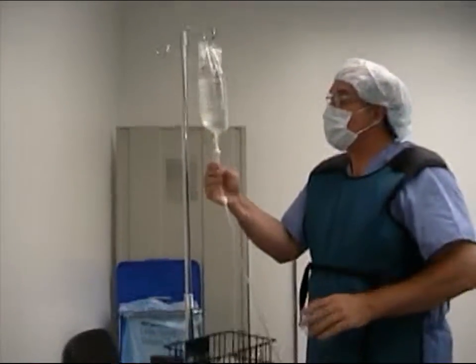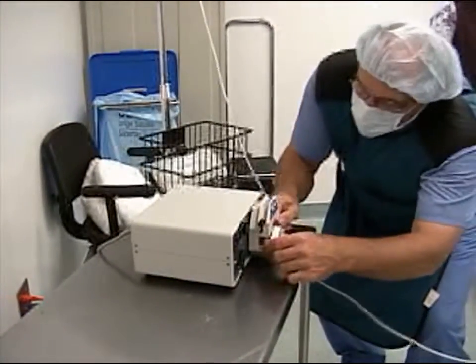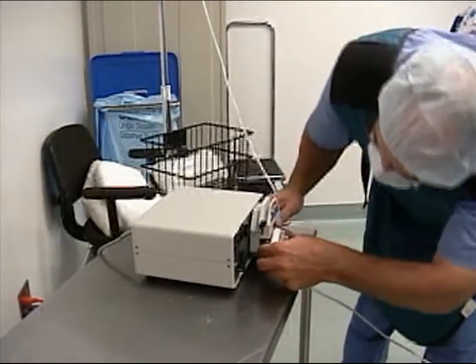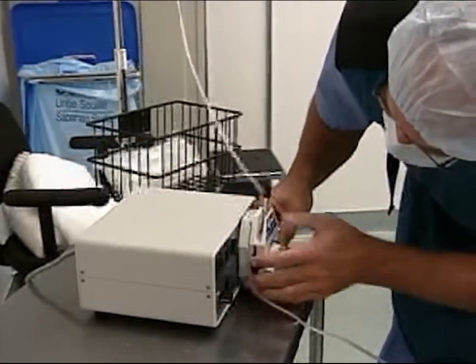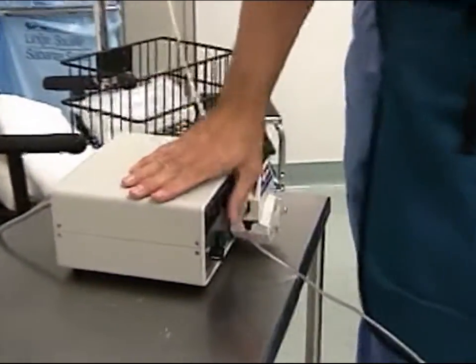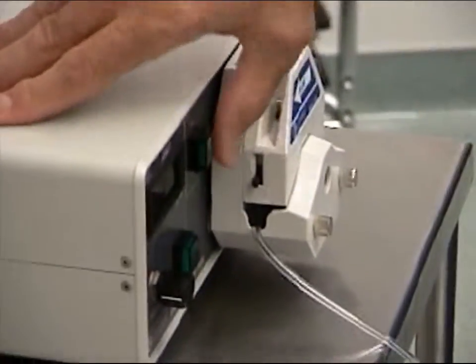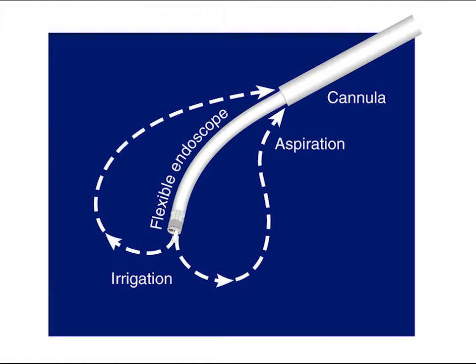Connecting the irrigation is also easy. One end goes to the LASE endoscope's irrigation line, and the other goes to a 1-liter bag of normal saline. Put the irrigation line into the endoscopy pump and close the pump head. Prime the pump, then set the pump to deliver 30 cc's of saline per minute.